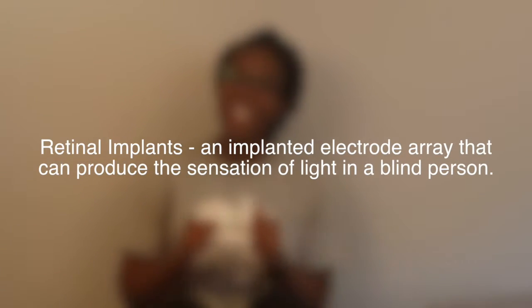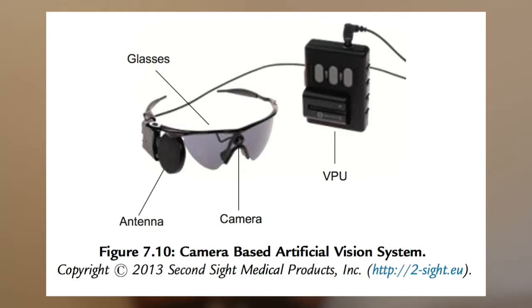And so, something that we could be thinking about for improving these retinal implants is having an integration of a denser array of microelectrodes to stimulate more neurons, or maybe having a flexible electrode array which is capable of stimulating the inner retina.